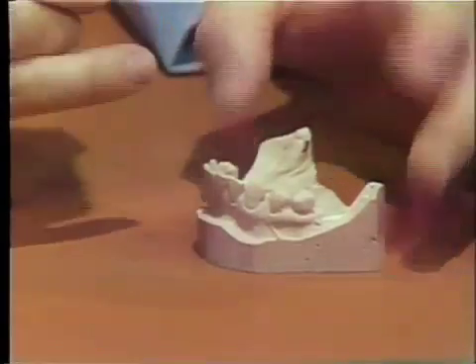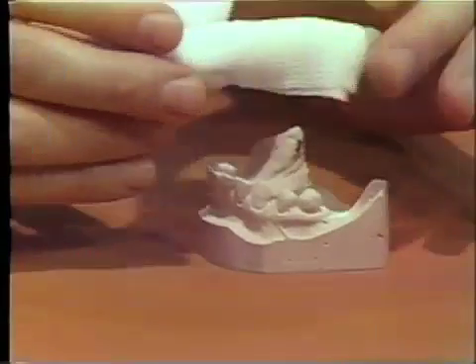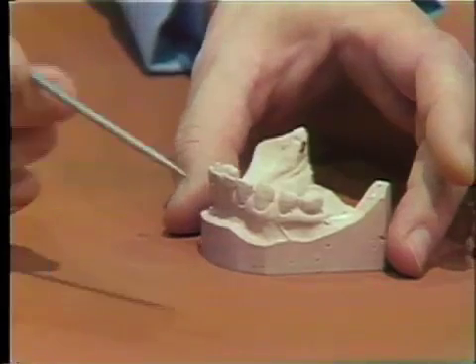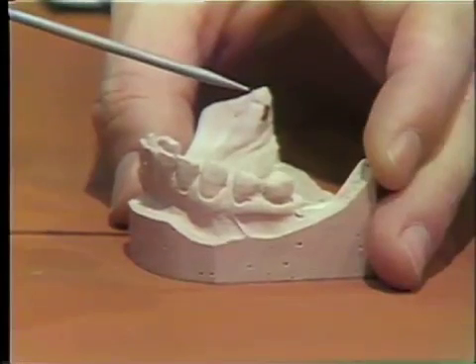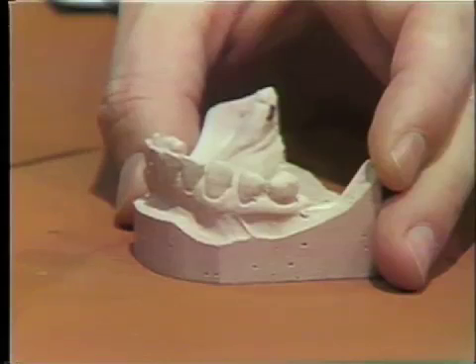Sometimes the salivary glands will seep slightly and little pools of saliva will displace this impression cement. If the patient is very nervous, it's wise to premedicate them with a sedating agent. And if a patient is a gagger, especially in a maxillary situation, it's wise to have them gargle with viscous xylocaine to anesthetize the soft tissues.